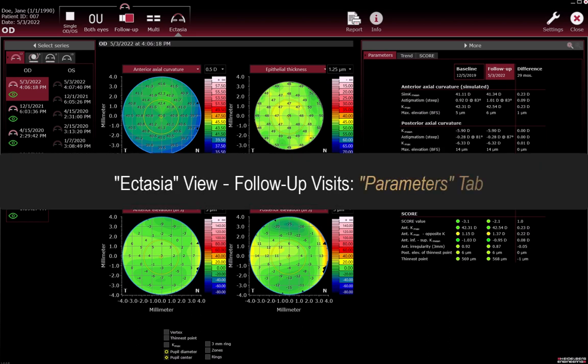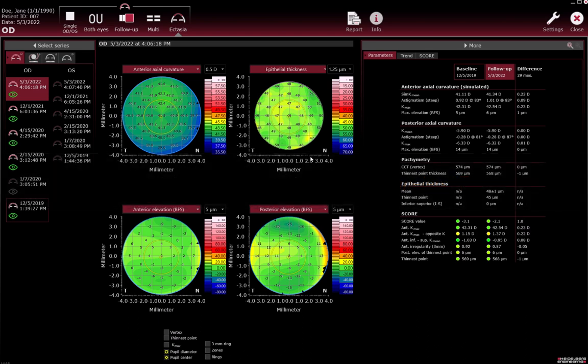Ectasia view follow-up visits — Parameters tab. On the Parameters tab, review the differences in the measured values between the baseline and follow-up examination. The oldest of the examinations selected in the Select Series section is automatically selected as the baseline examination and is marked by a red frame. If the automatically selected examination is not the baseline examination you want, deselect the examinations you do not want to use as baseline.